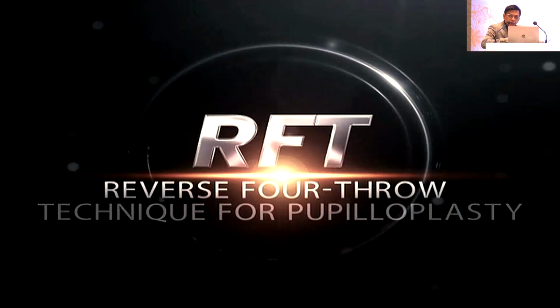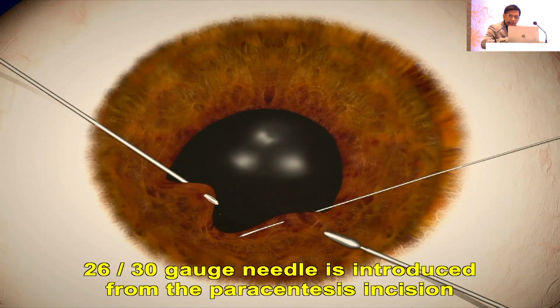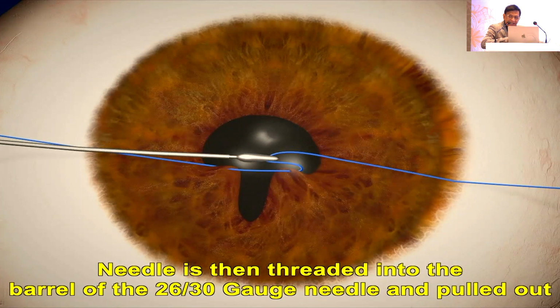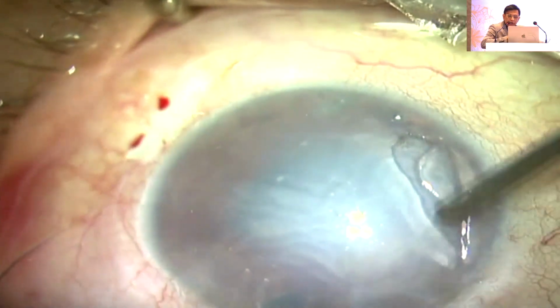What about reverse 4-throw? I showed you single pass. In reverse 4-throw, we are going from behind the iris. So what happens in this case is, and I have to give credit to Dr. Priya Narang for this also. So you see here, the knot or the tail goes behind the iris. The advantage in this is, suppose you're having a PDEK graft or any graft, the tail will not hit it.